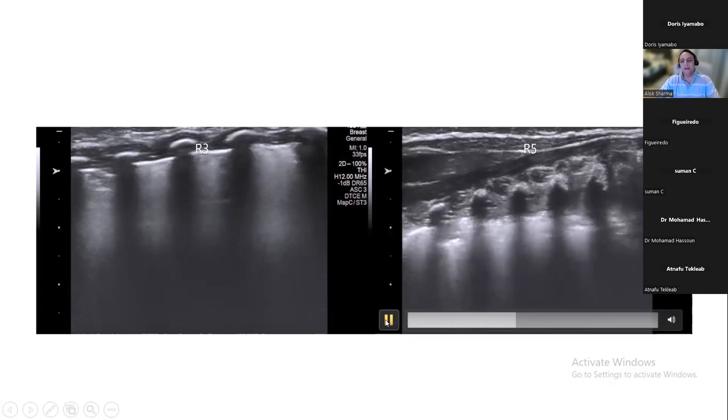Yes. Okay. So what I'd say is that some of these babies will have chronic changes with meconium aspiration. And really in those situations, you can get shred sign. I would probably avoid the snowflake terminology for this setting. I try to keep it for the grades of RDS. Any questions? So I've got Doris who's raised her hand.